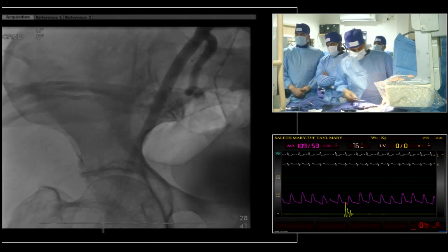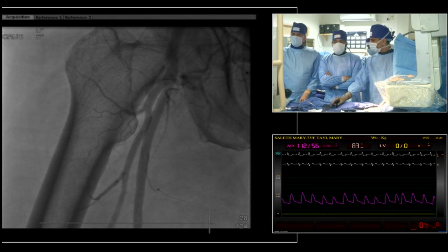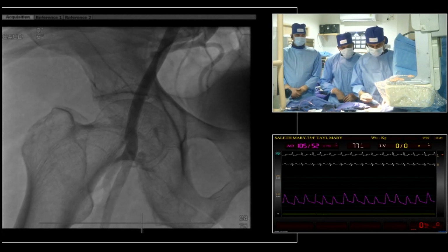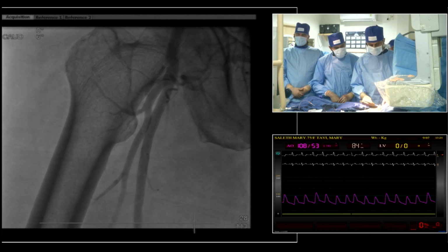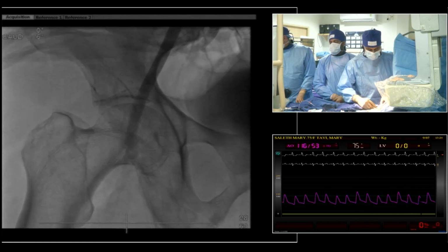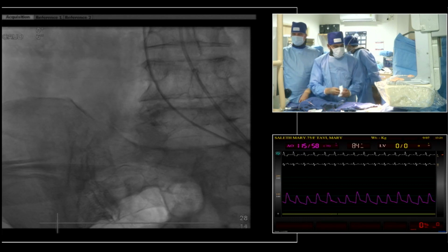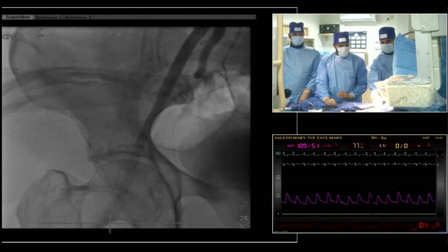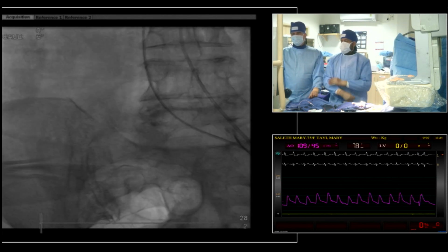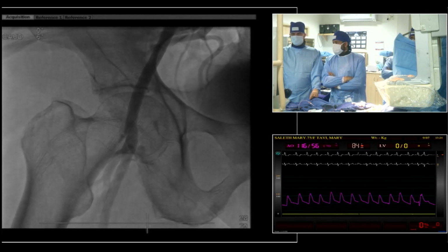So maybe we should have a discussion, Kentaro and Thierry. We have a relatively narrow left bundle branch block. What's your view about leaving the temporary wire in? What is the QRS width? QRS is probably 140. For me, it's okay, so no pacemaker. What's your experience with the MyVal? The likelihood of this progression is very small, and I'm not concerned about it.